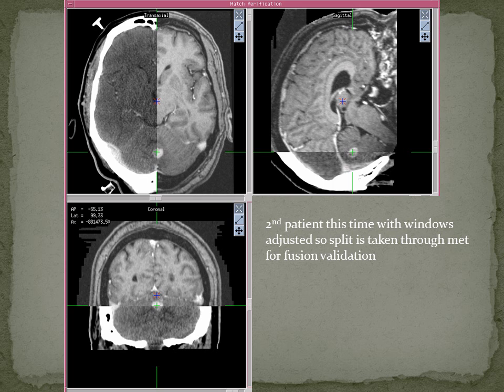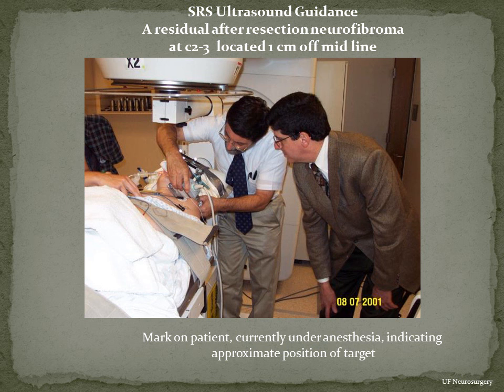Sometimes, as in this one of the scans, we actually did have contrast in both MR and CT, and you can see that the CT scan contrast is not nearly as robust as the better imaging the MR scan presents to us. Okay.